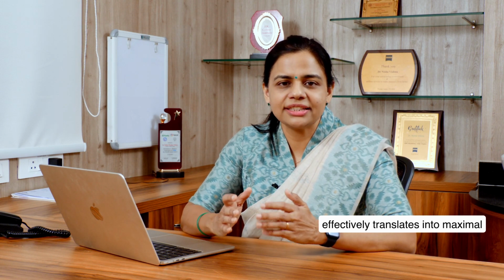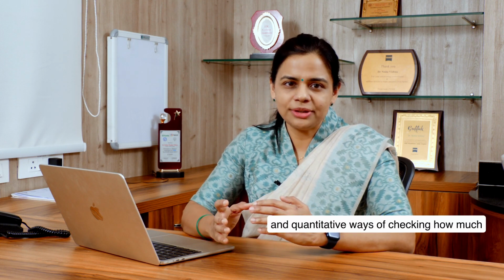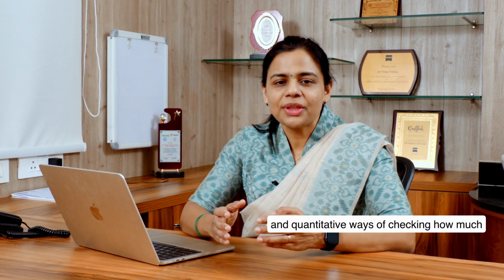Your radiation oncologist then will sit with the physics team and run through the plans, checking each and every aspect of dose. A good plan is the plan that most effectively translates into maximal effect with minimal side effects. We have qualitative and quantitative ways of checking how much dose is being received by what organs. Once we approve the plan, it goes into the machine for execution.